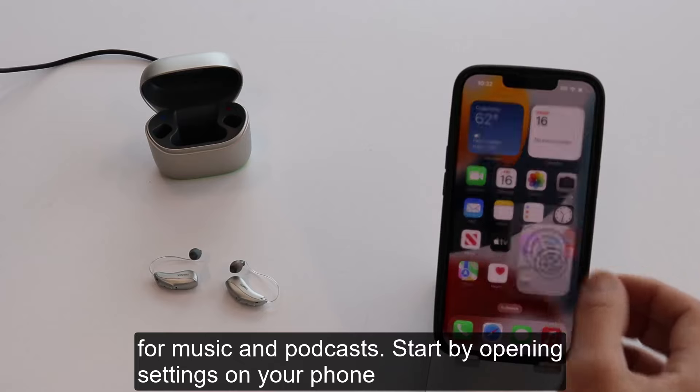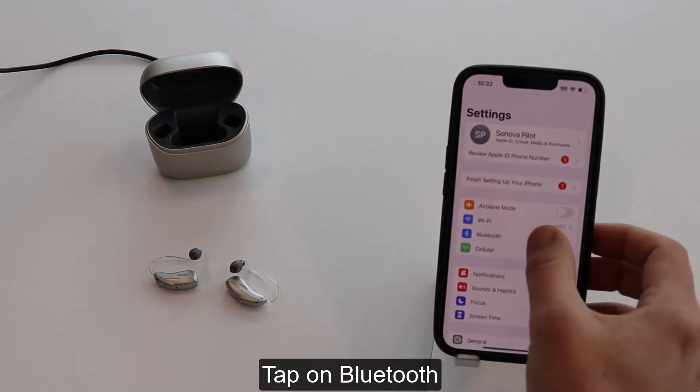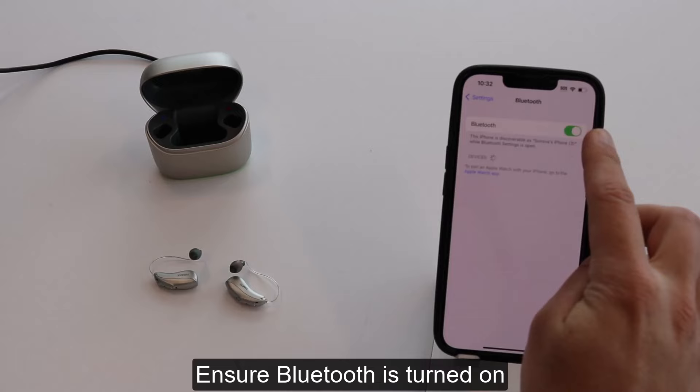Start by opening Settings on your phone. Tap on Bluetooth and ensure Bluetooth is turned on.